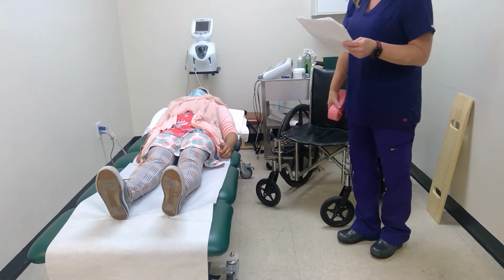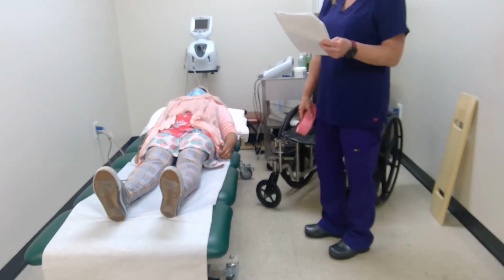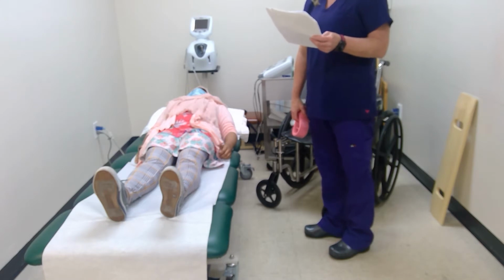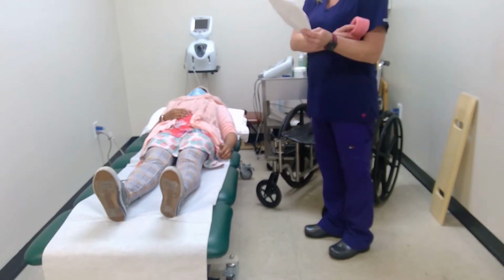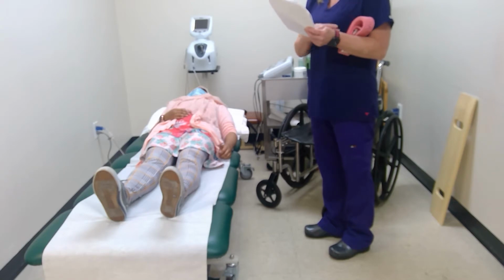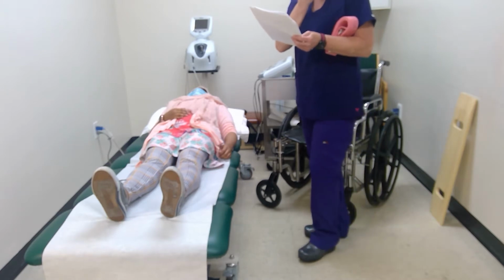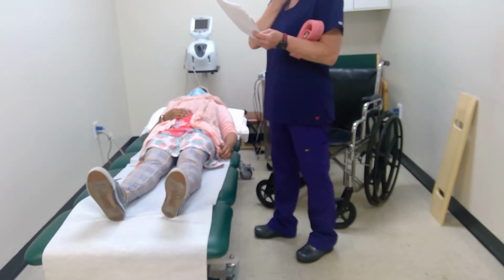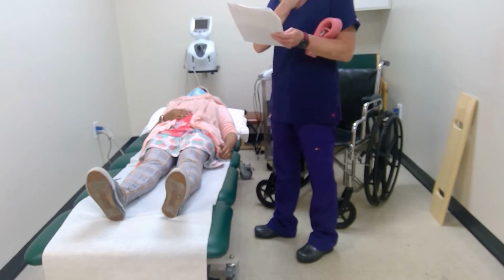Okay, I have case number 3, which is demonstrating a lateral transfer with a sliding board. The client is a 40-year-old female who has a recent diagnosis of a right traumatic above the knee amputation and an abrasion on her left lower extremity, secondary to a motor vehicle accident. She continues to require an IV fluid and pain medication. Her diagnosis history is uneventful.